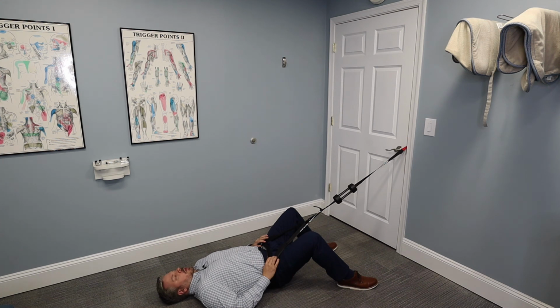This is a great alternative for at home, or even if you're traveling, it can be folded up really easily. I highly recommend this for patients. So that's what the Fisher traction unit looks like for your lower back.